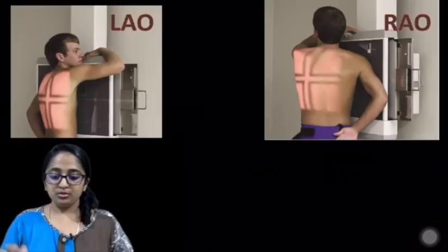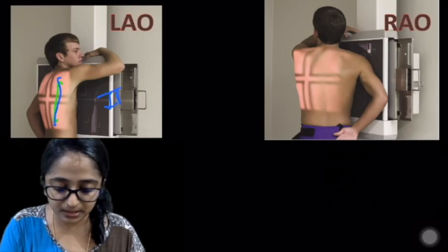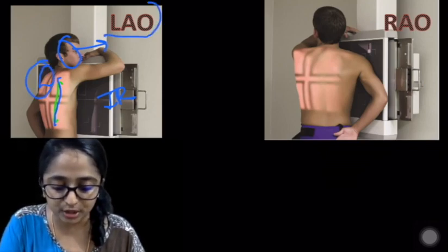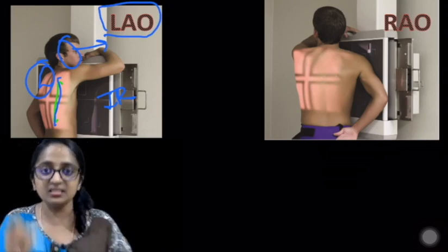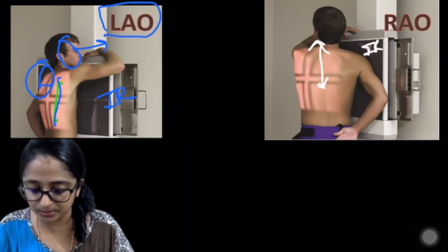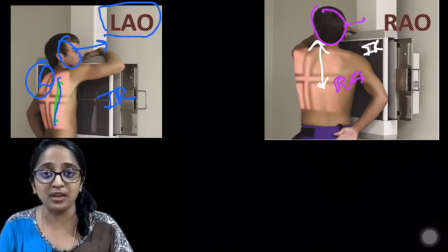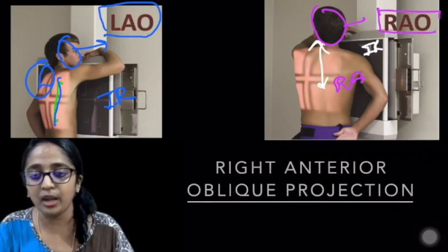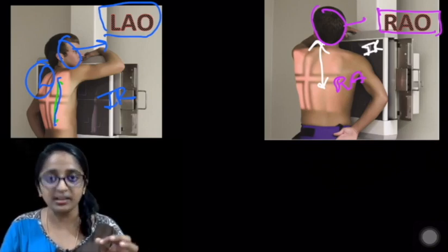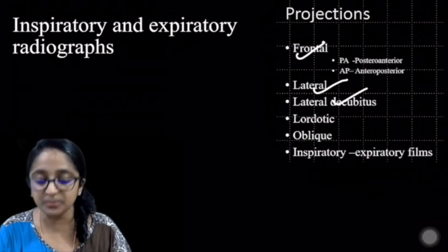Moving over to the oblique projections. In this figure, the patient is facing the image receptor with the left anterior aspect of the patient's chest touching against the cassette — this is known as LAO or left anterior oblique. Whereas when the right anterior aspect of the patient's chest is touching against the cassette, it forms the RAO or right anterior oblique projection. Similarly, you can also go for LPO and RPO — left posterior oblique and right posterior oblique projections — with the corresponding sides touching the cassette.